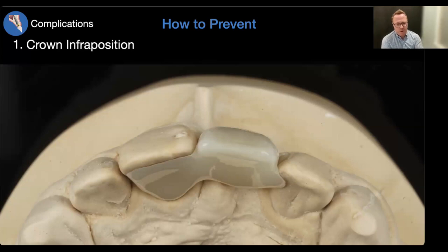It's been shown to be much better in terms of one wing with a cantilever than trying to bond to both adjacent teeth, because of the differences in movement that occurs and some challenges that we can run into with that. So that's what we did for this patient.